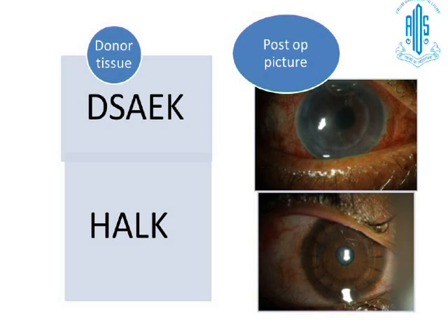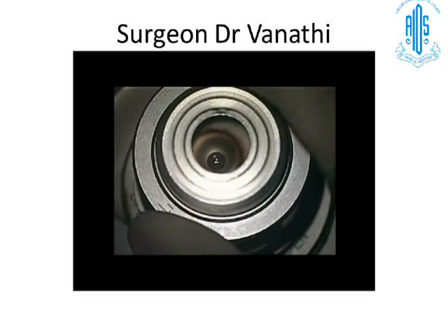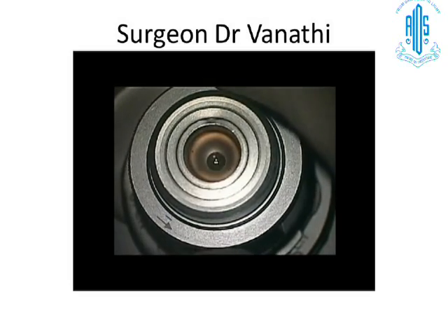And then with the rest of the cornea, one was also able to do a DSEK in this patient. This is an example of the patient who had the DSEK and the HALK post-operatively. The surgery was done by my colleague, Dr. Vanathi.